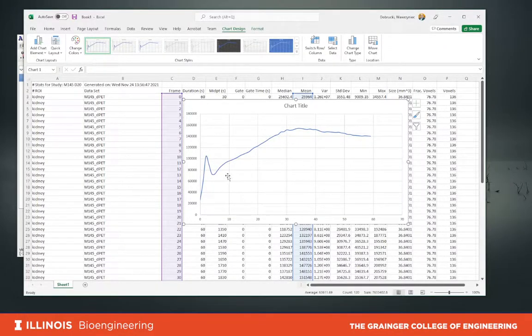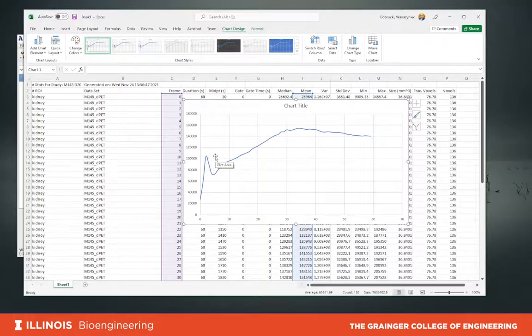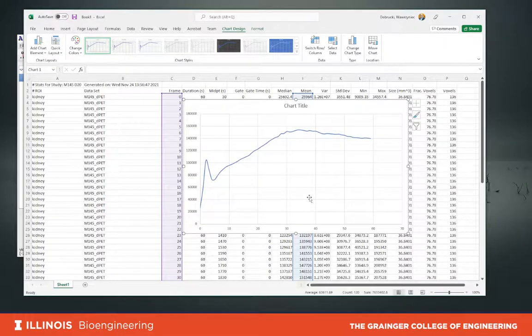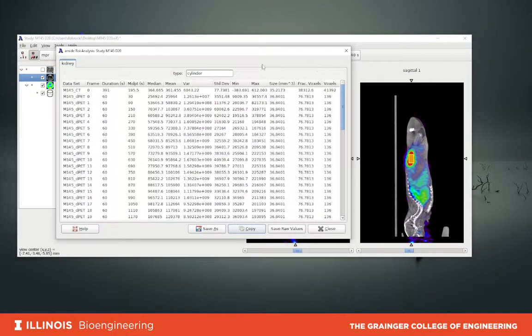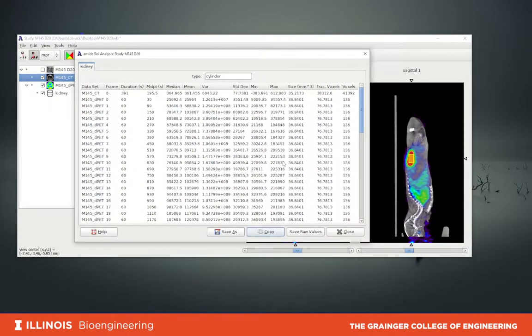Your job will be to calculate, based on this graph, what is the time when the activity reaches 50% in the blood. This is a parameter which we often report during the analysis. That's everything on how to analyze the dynamic datasets — using a table that provides information about the time after injection and the mean value of the activity.